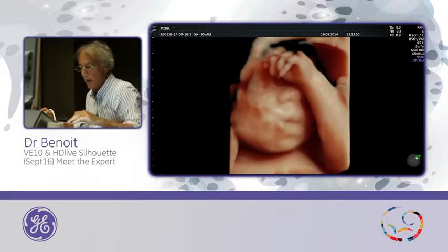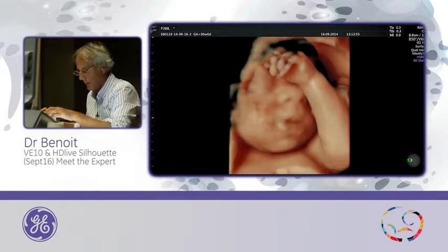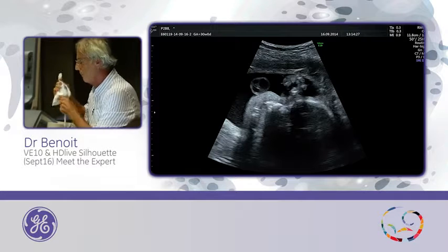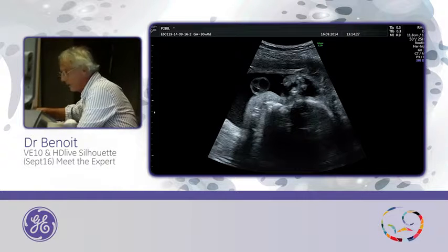And HD Live, or this one, move the position of the light. And it's okay. So now I will open some cases. We can thank this baby because he was a perfect baby. Thank you.